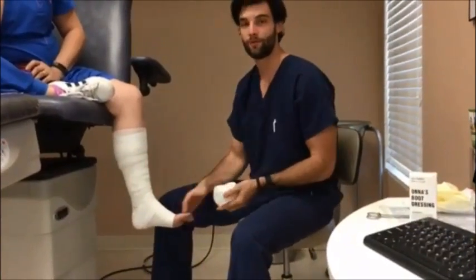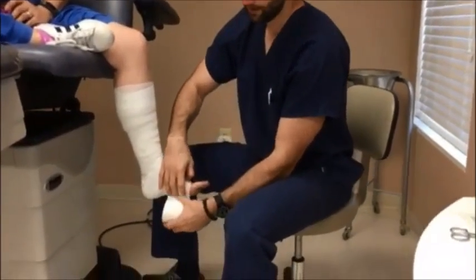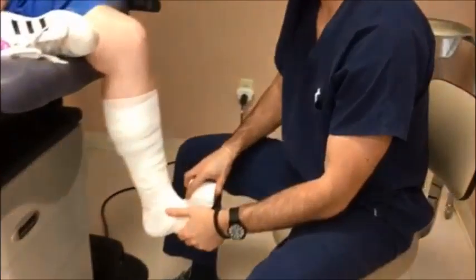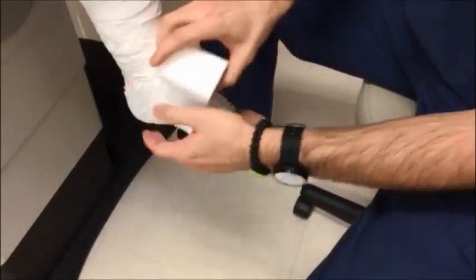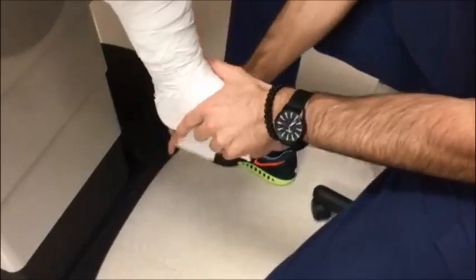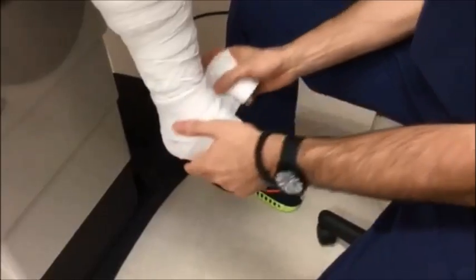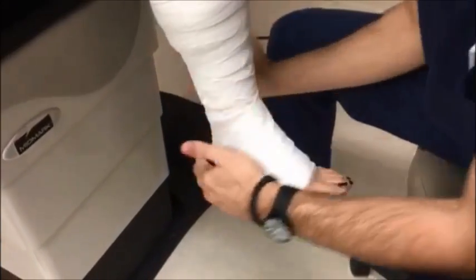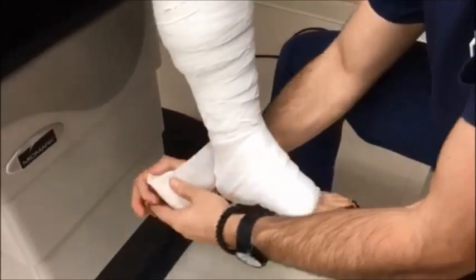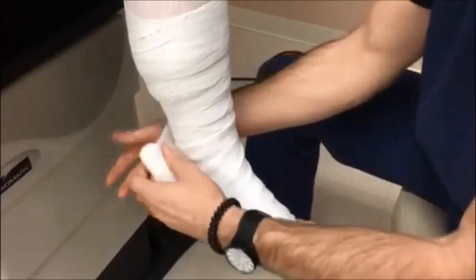Then after you apply the Unna Boot wrap itself, you're going to apply cast padding. And because we're applying cast padding, you want to make sure you do not get the Unna Boot wet, just like you would any other cast. And you're going to apply it in the same fashion as you would the Unna Boot wrap minus the overlapping. So you go around the metatarsal heads, around the foot, and then around the heel. Make sure you're covering each spot of the Unna Boot itself with the cast padding. And we do 1 layer of cast padding.